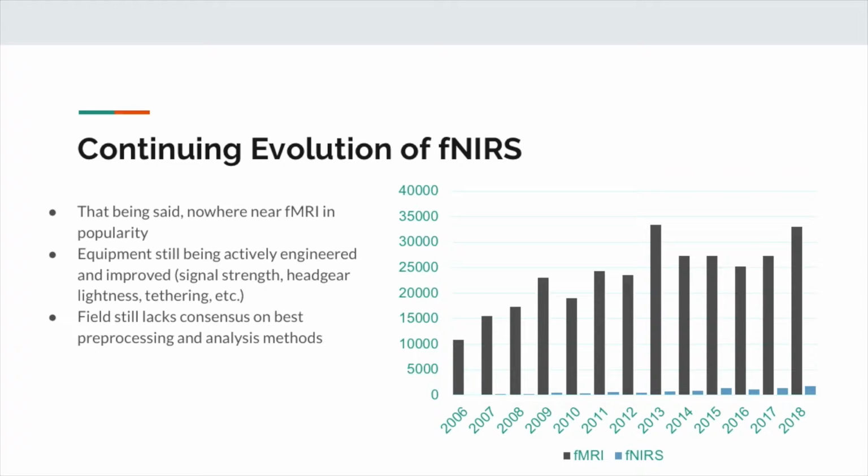And the equipment is still under what I would call active engineering, so they're always improving the quality of the material that's being used to measure activity, the engineering design, how light and comfortable the headgear is, and things like that. And the field still lacks consensus on best pre-processing analysis methods.